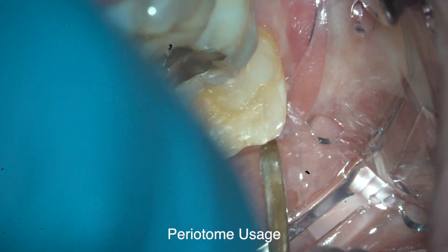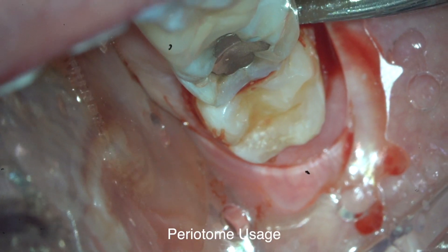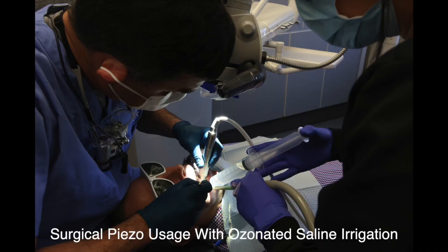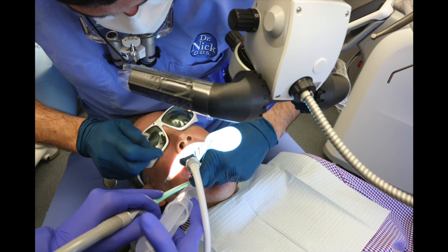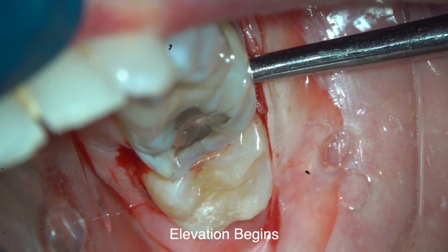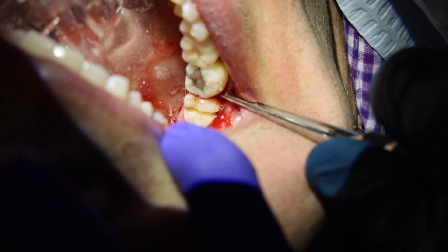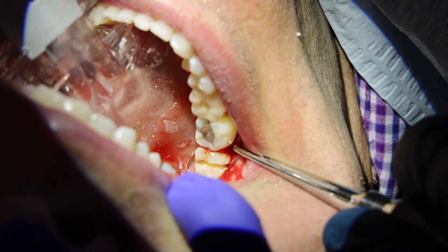Is that hurting at all? You're going to feel pressure, but it should be no pain, okay? Get some — is that saline? So what I just did was, remember I was talking about the two roots? I cut the tree in half, so to speak, so I can get out one root at a time.